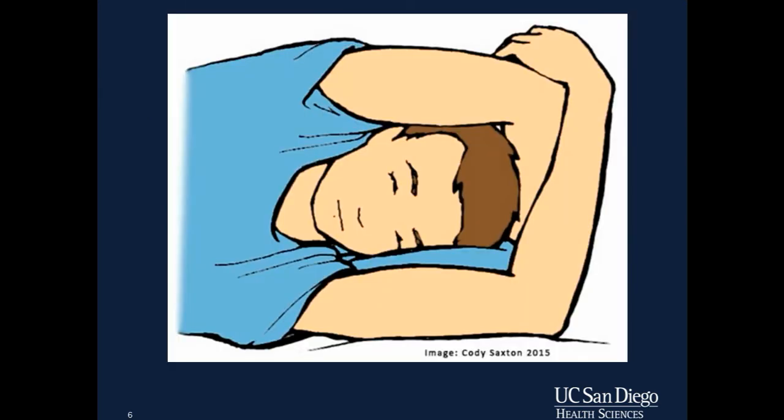The patient should be placed in the supine or lateral decubitus position with his or her ipsilateral arm raised above the head. You may also find that having the patient take a deep breath in or out may help move the kidney into a better view. As always, be sure to explain the process to the patient before you begin.